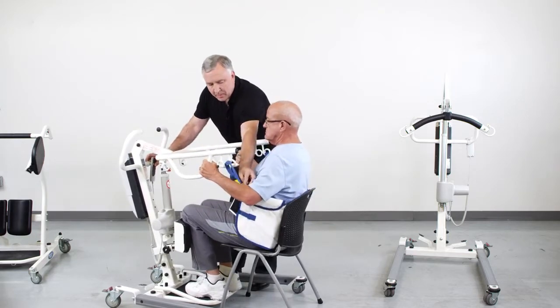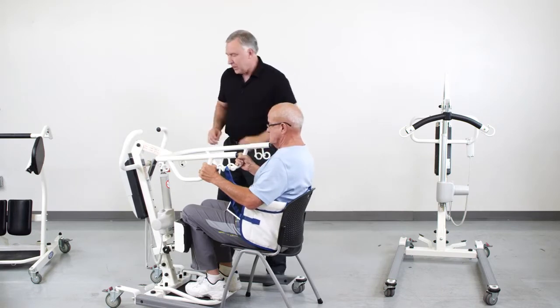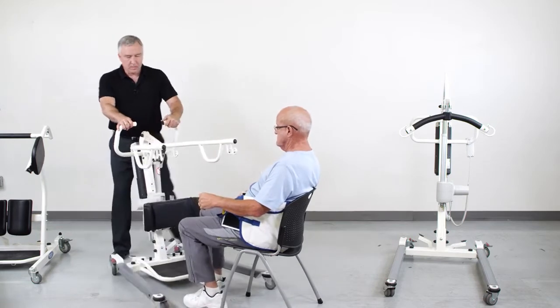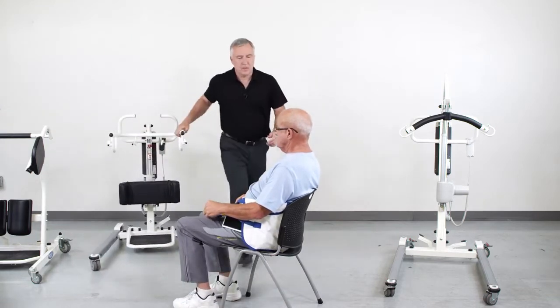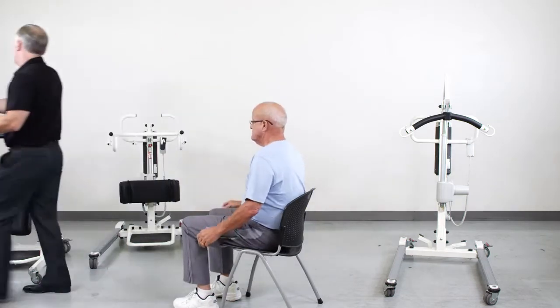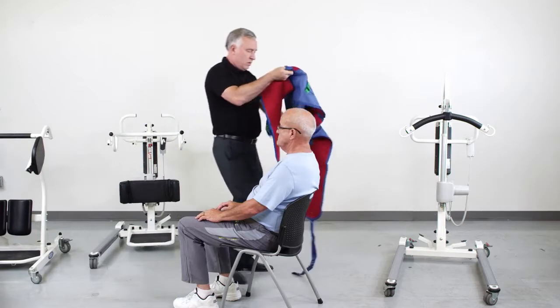What's important to understand about the stand assist device is that with all of these slings, we still can get the patient to the restroom. So now we require complete support.